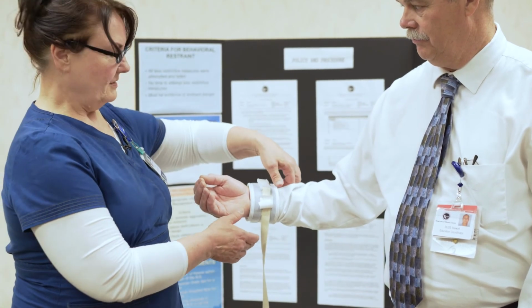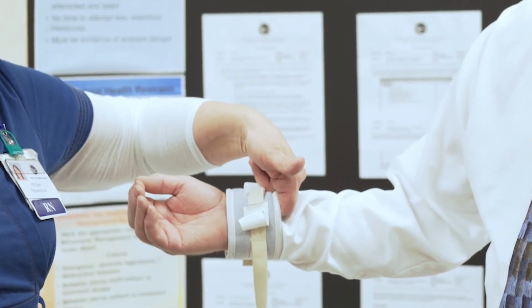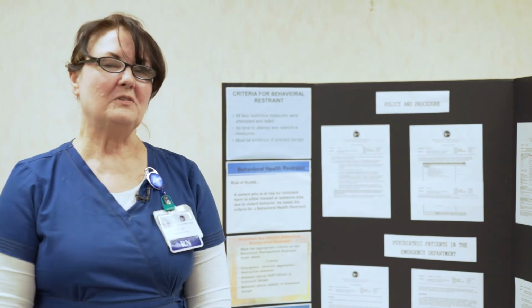Very, very important is you want to make sure you can put your fingers underneath there. If you can't do that, it's on too tight, and that's going to be a problem. You'll cut off the circulation. You'll have another injury.